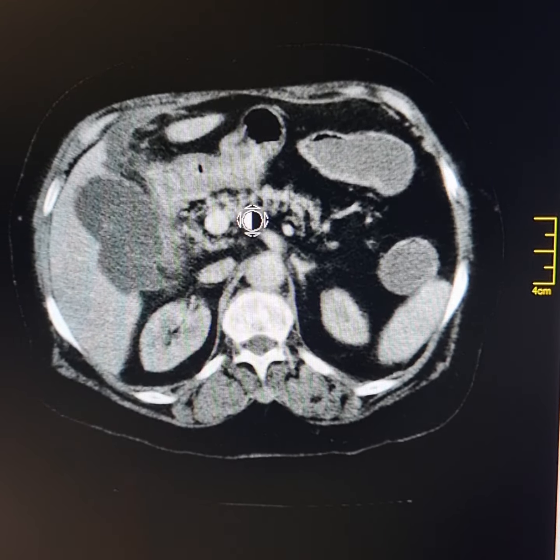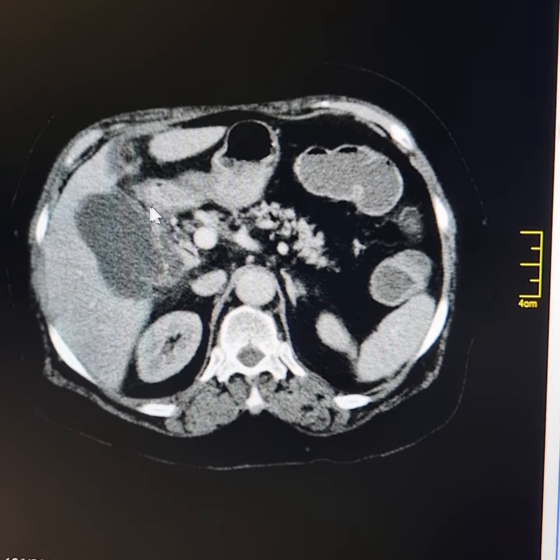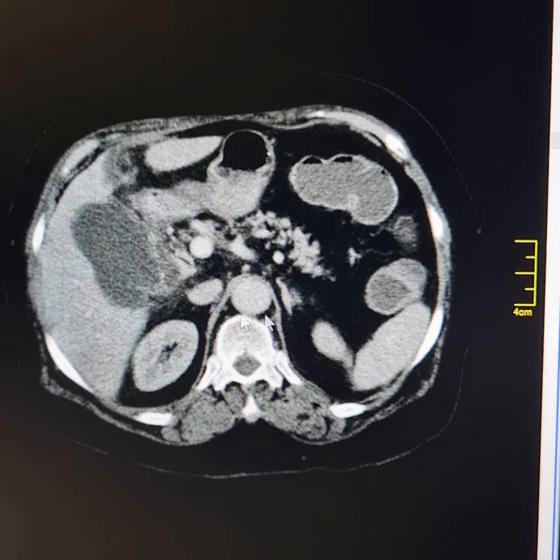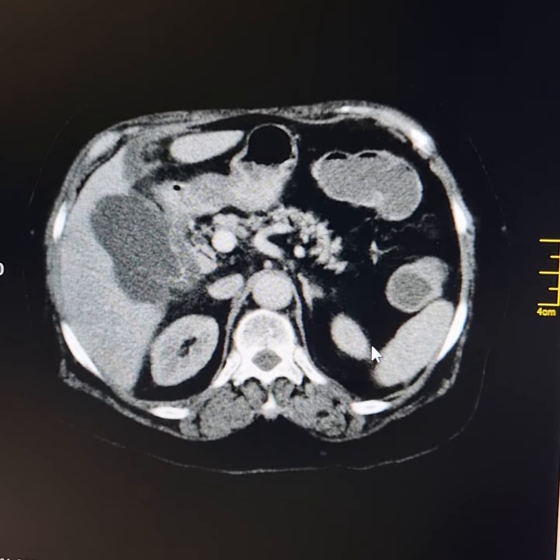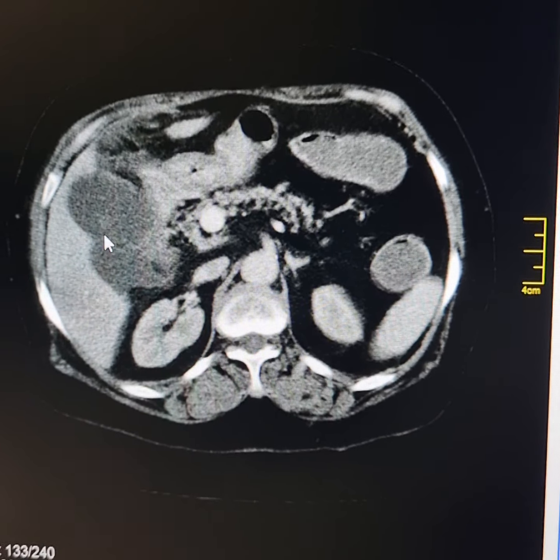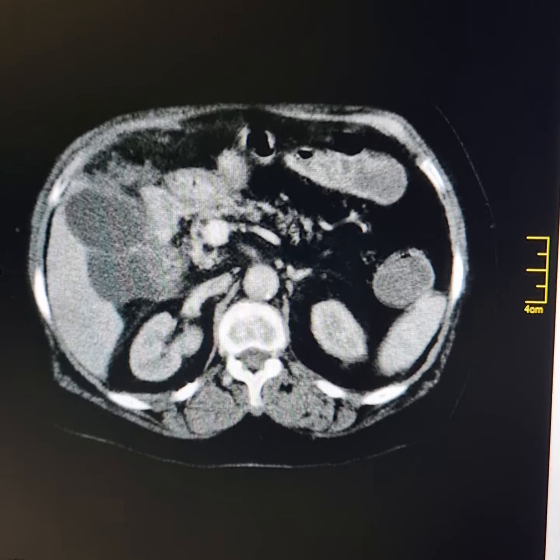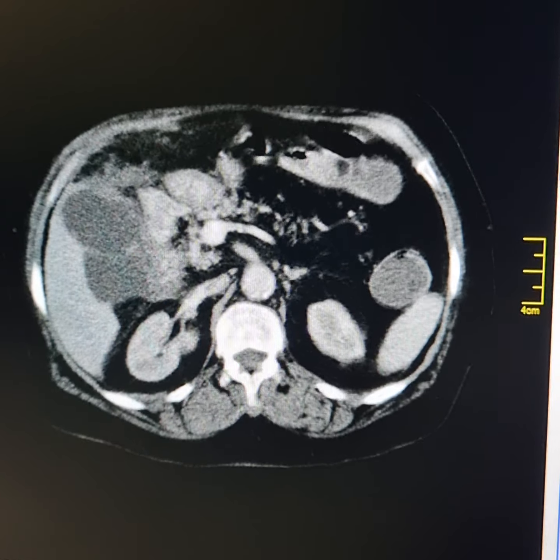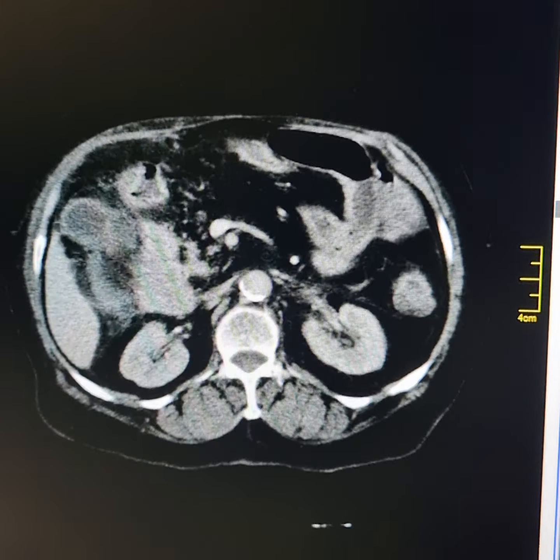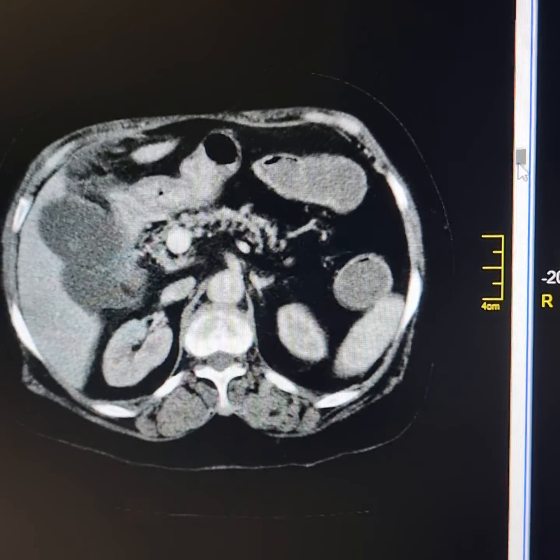Its wall is not appreciable at places. Now this is the gallbladder. The patient is a known diabetic. Posteriorly its wall is not appreciable and there is a fluid collection lying posterior to the gallbladder. This is suggestive of a contained perforation of the gallbladder.